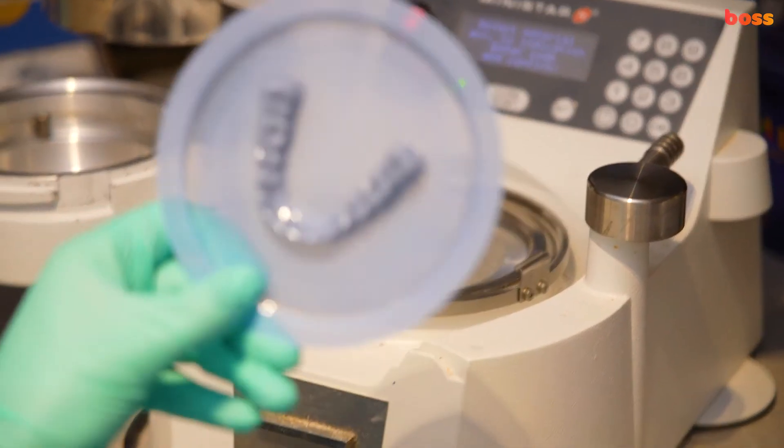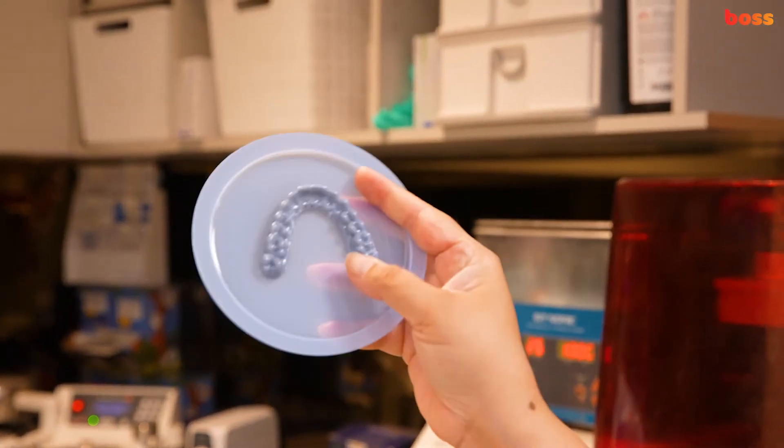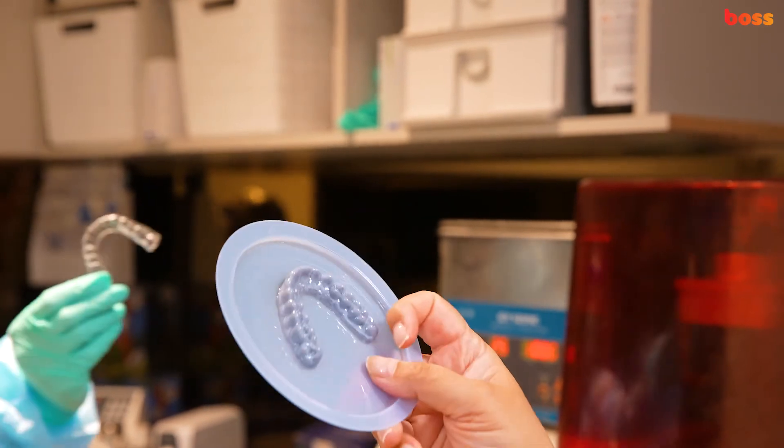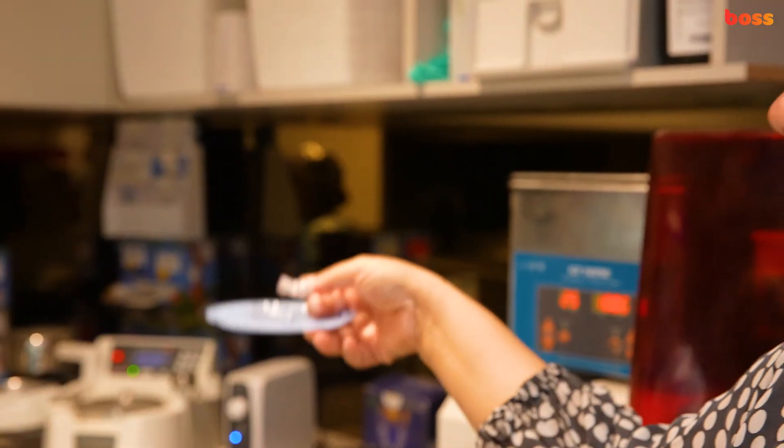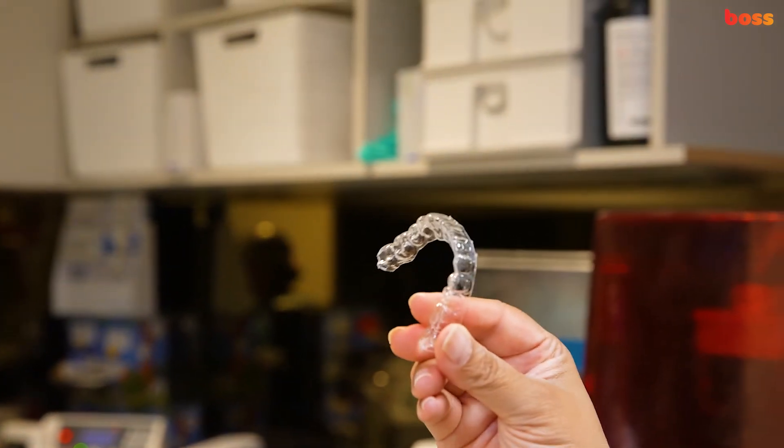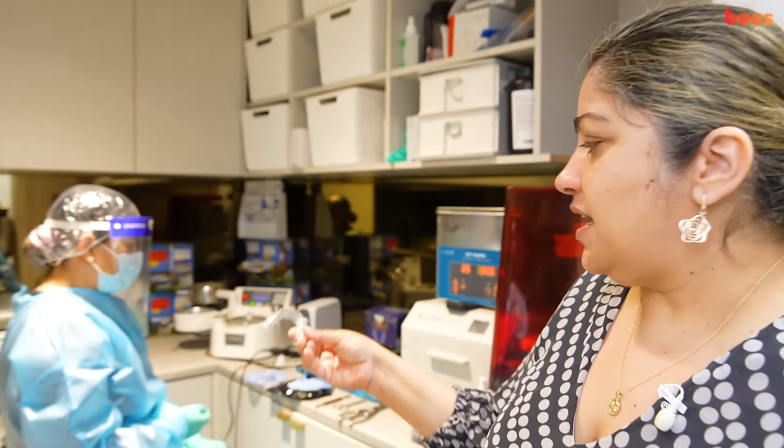Here we have a vacuum formed retainer over this 3D printed model, and what we really want to create is this finally. Now this can be done very quickly if you have a 3D printer. From scan to print could be 20 minutes, and you can see how quickly that was done.